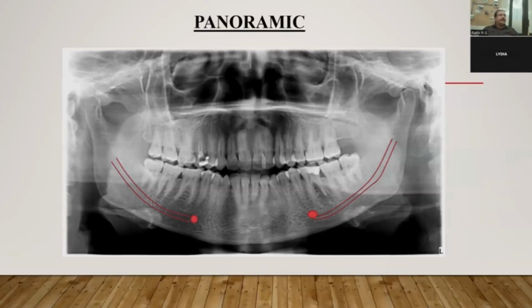So that will be more ideal in this case. Your idea will be to go in for a hemisection, place an immediate implant with sufficient primary stability, and graft that area, if possible, with your sticky bone. That itself has some amount of bone graft present in it. So it is bone graft mixed with growth factors plus a biologic barrier membrane, not the collagen barrier membrane, which will come into contact with the two nearby teeth.